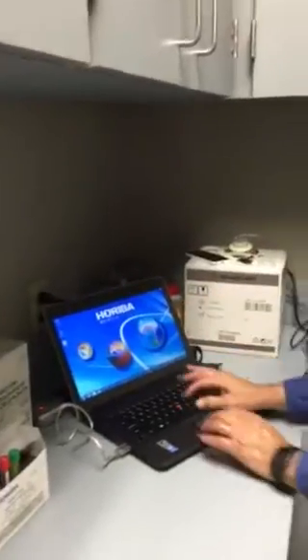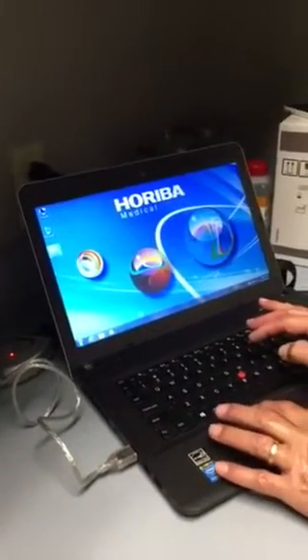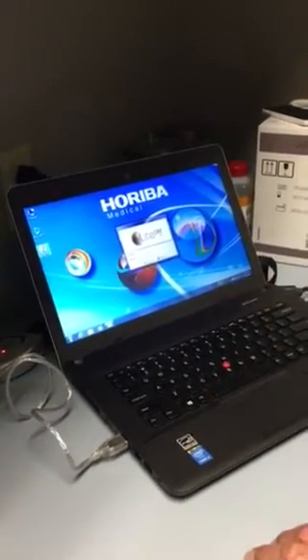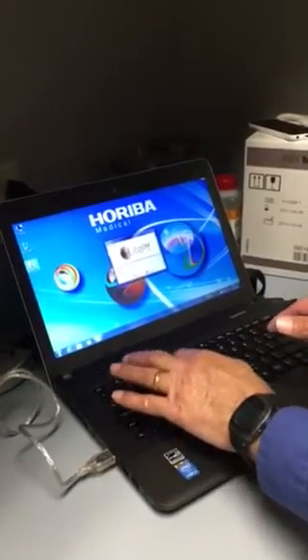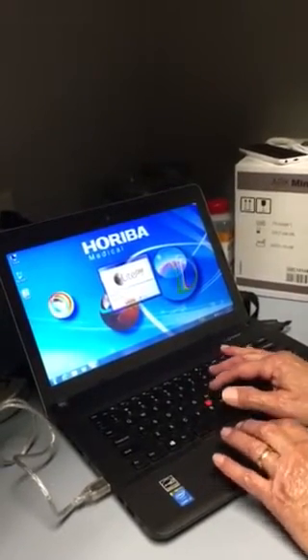Once the desktop comes up, you want to double-click on the LightDM. Just hit this left button here, and for now we're just going to use the default login, which is user/user — small caps, user user — and we'll log in. Once we're in there, we can set everybody up with different logins if you want.